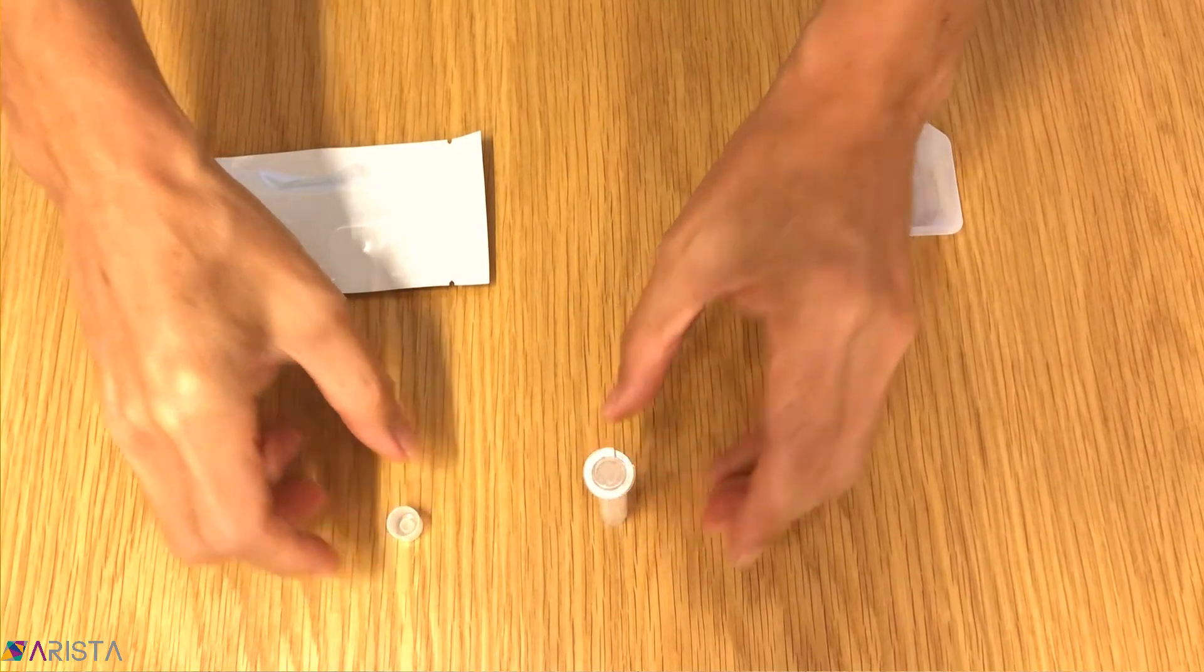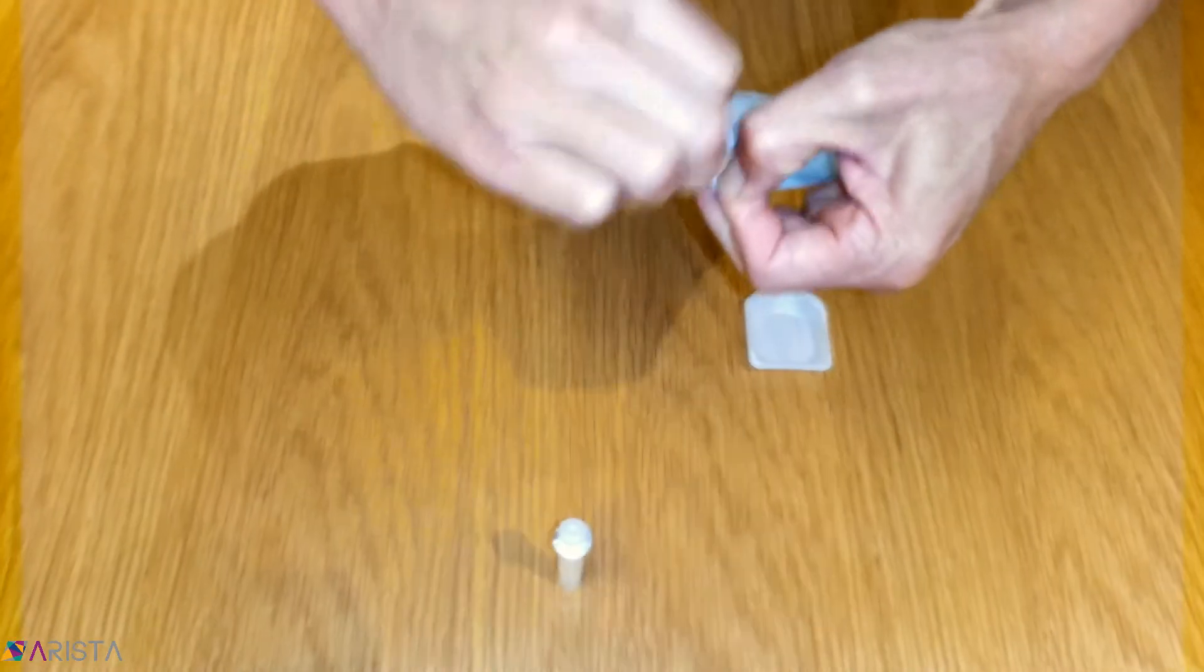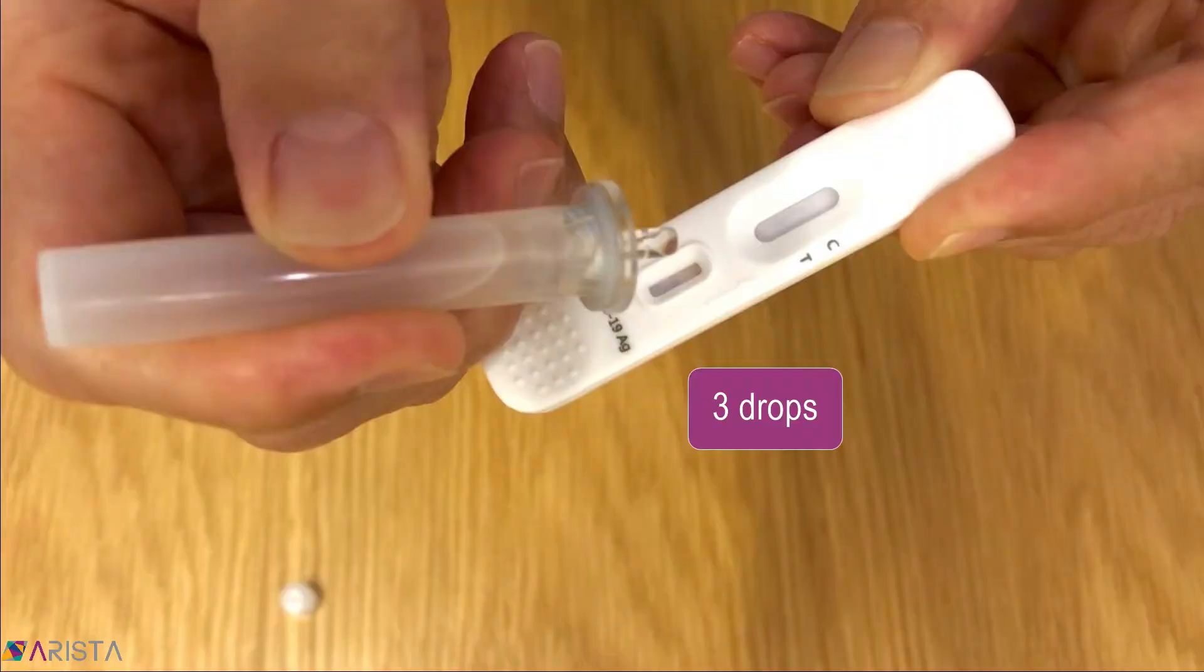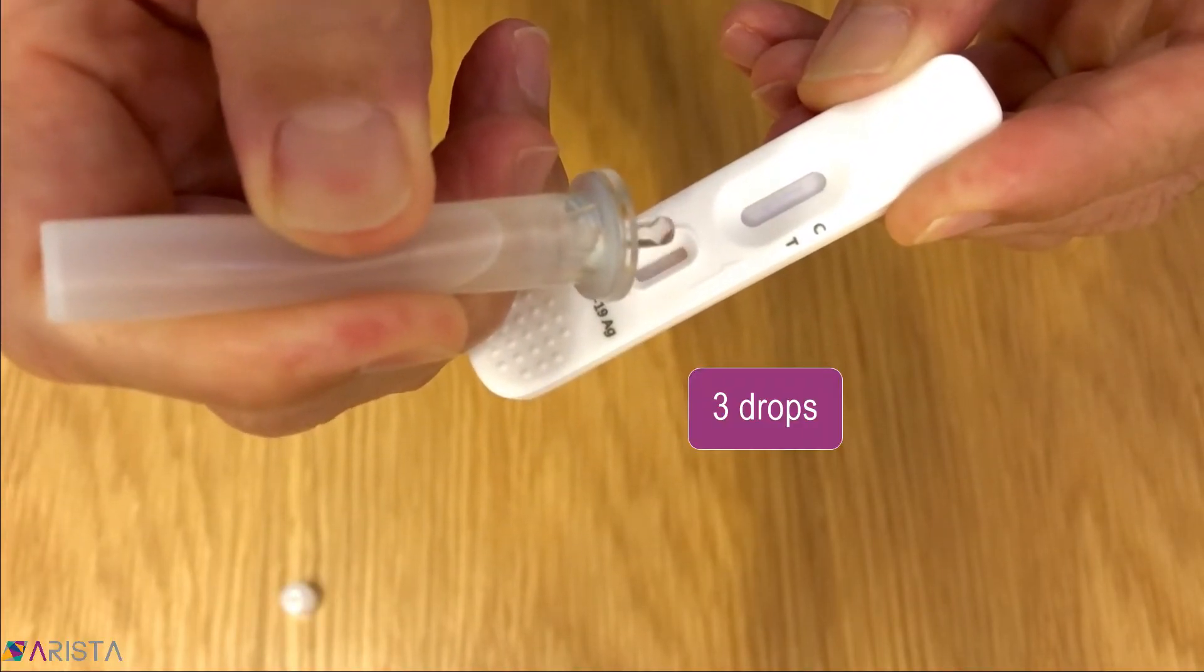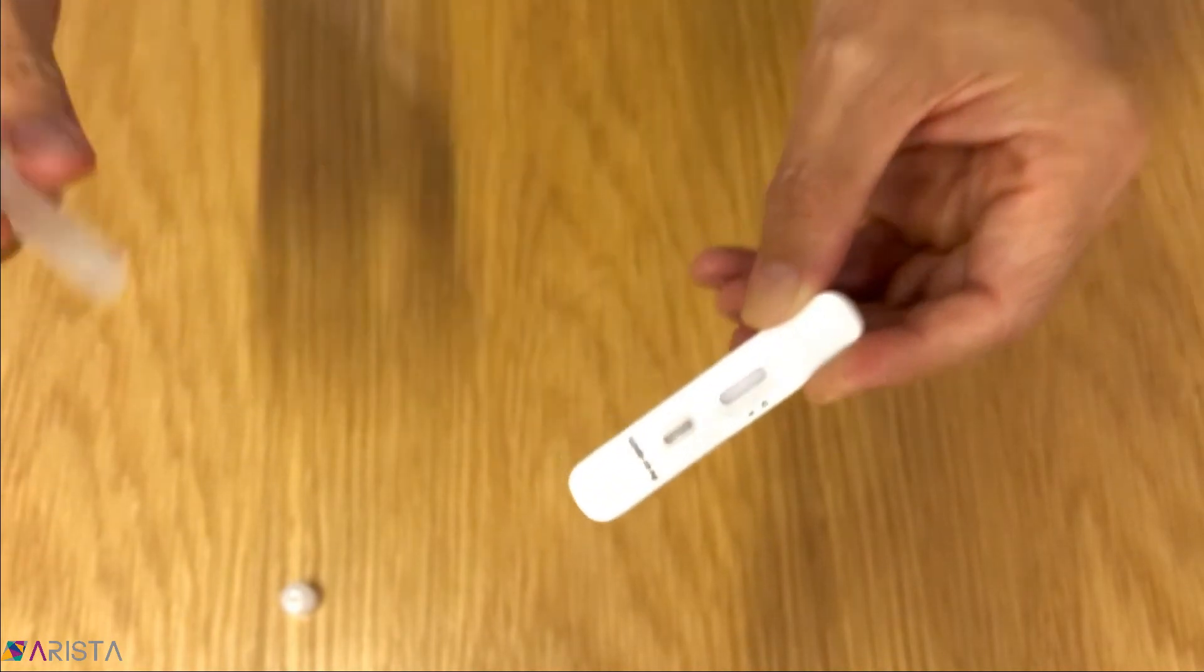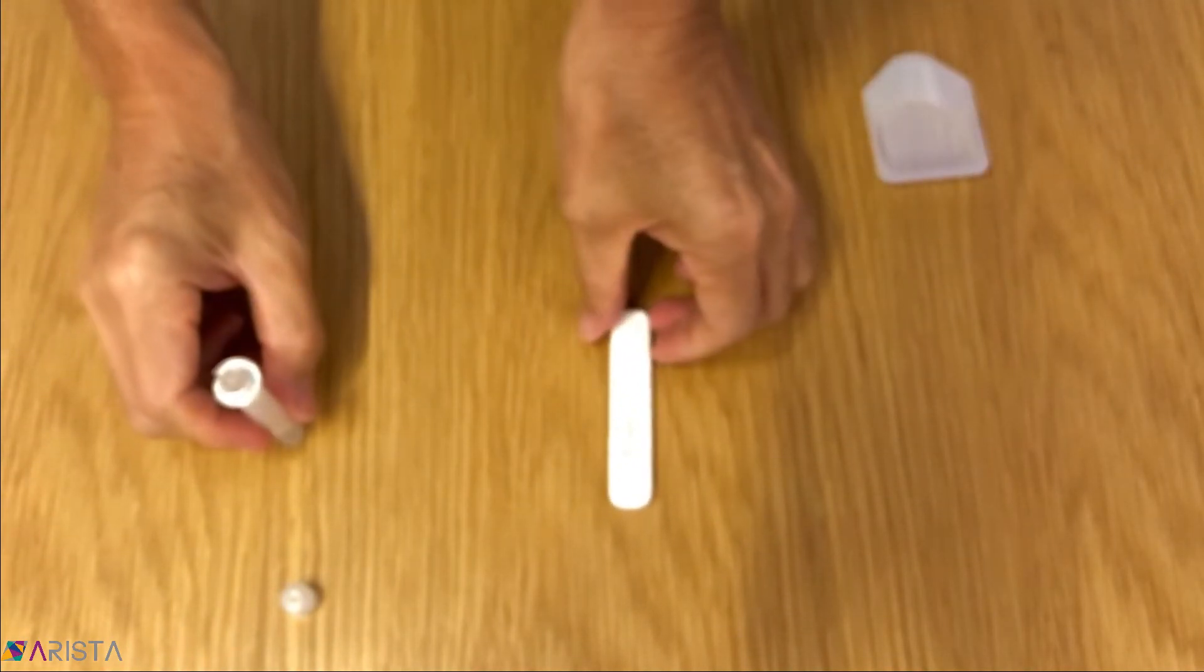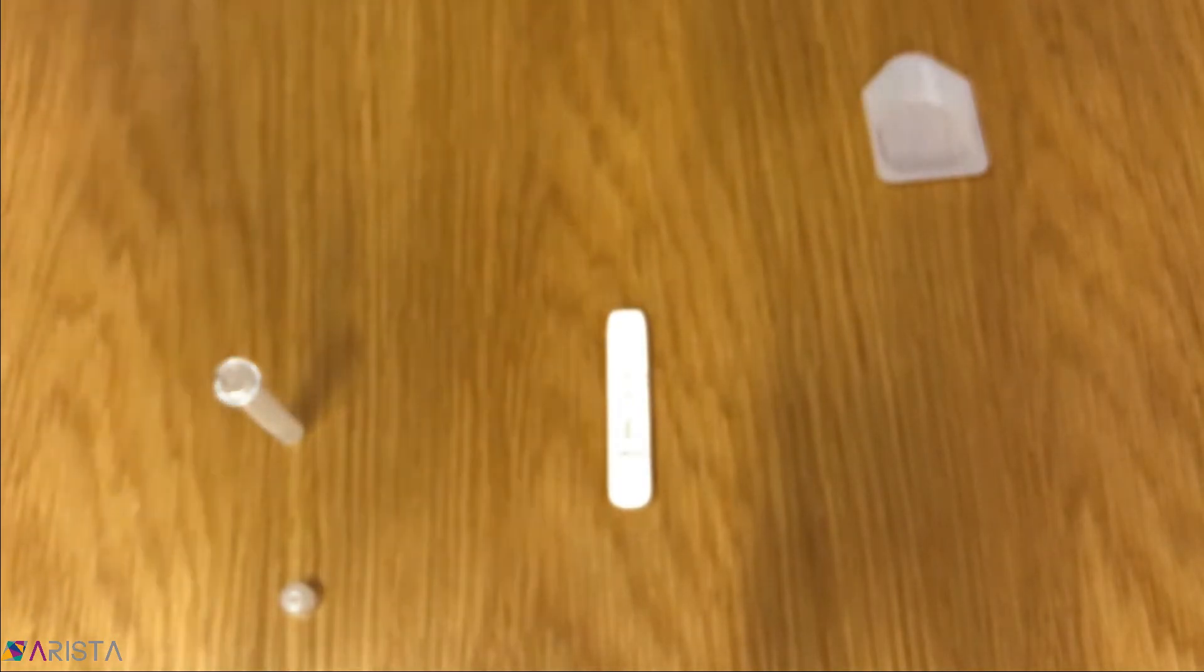Remove the test cassette from its foil pack if you have not previously done so. Invert the tube and squeeze three drops into the small sample well at the bottom end of the test cassette. You may continue the test even if you accidentally added four drops.